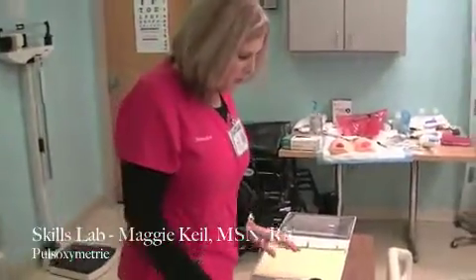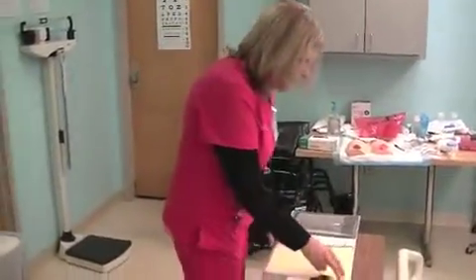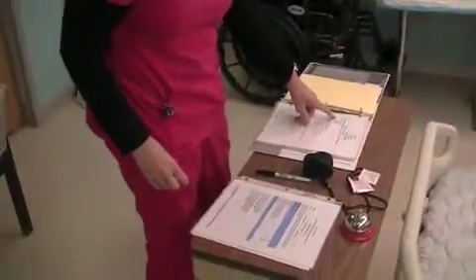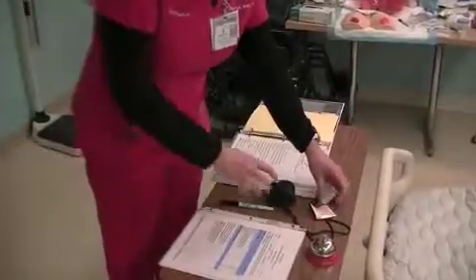Okay, today we're going to do monitoring pulse oximetry. So the first thing we need to do is go look at our doctor's orders, and check to see if there's any isolation precaution for a patient, because we can't go in the room with that. Then we're going to gather our equipment.